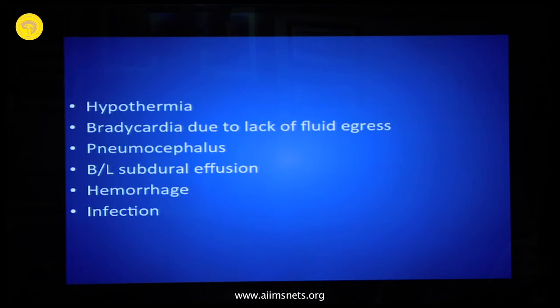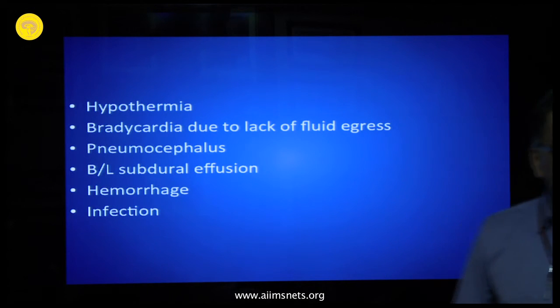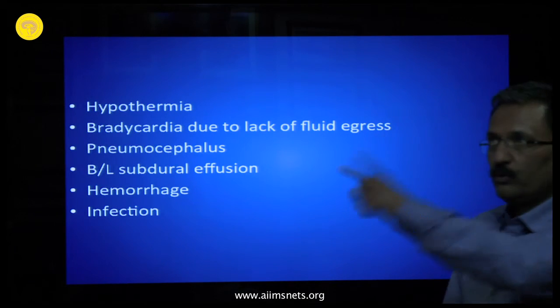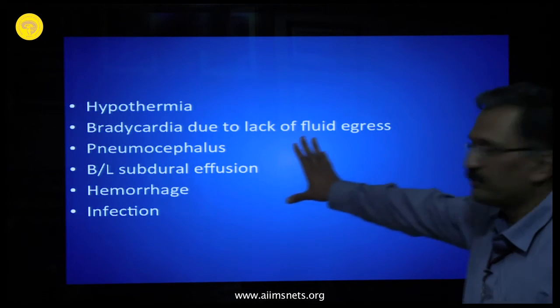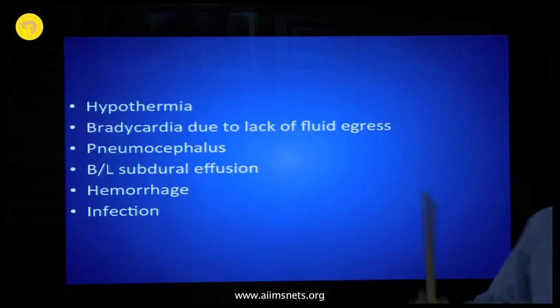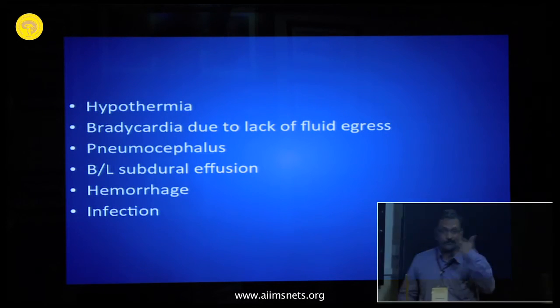And then, during your endoscopy, there are some problems that you need to look at. One is, of course, hypothermia, which I told you about. The second is bradycardia. Continuously you must tell your anesthetist, please look at the pulse. Make sure there's no bradycardia, because that means there is brainstem distortion because of excessive fluid accumulation. The fluid that you're irrigating is not coming out, right?